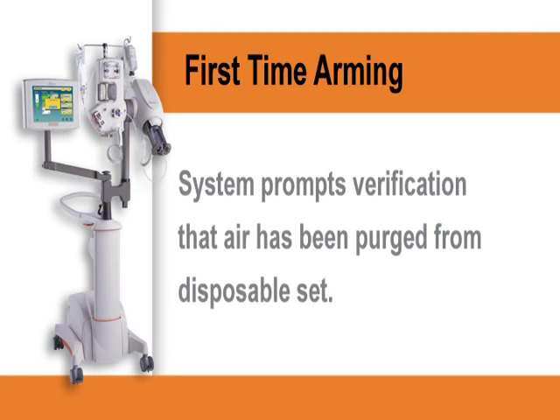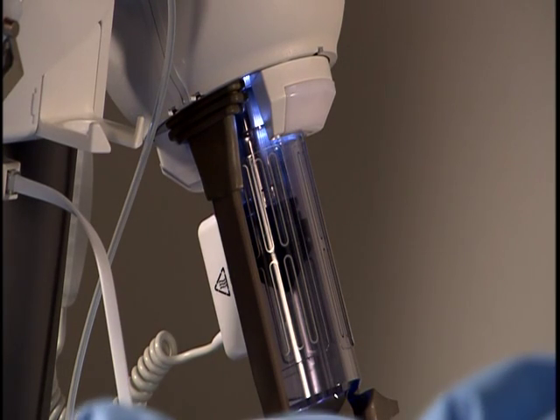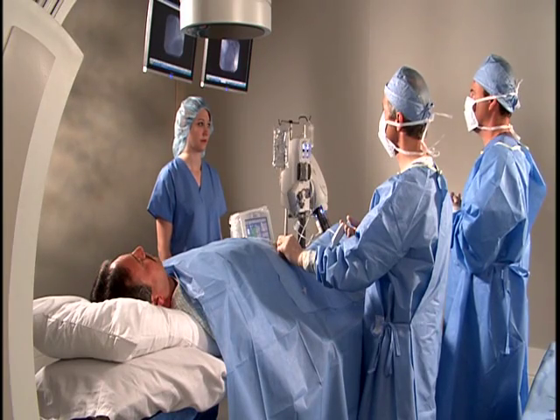When arming for the first time, a system prompt asks for verification that air has been purged from the disposable set. The Check for Air icon will have a yellow background and highlight if the operator has confirmed no air. The armed indicator light on the injector head will illuminate when the injector is armed and will flash during an injection.